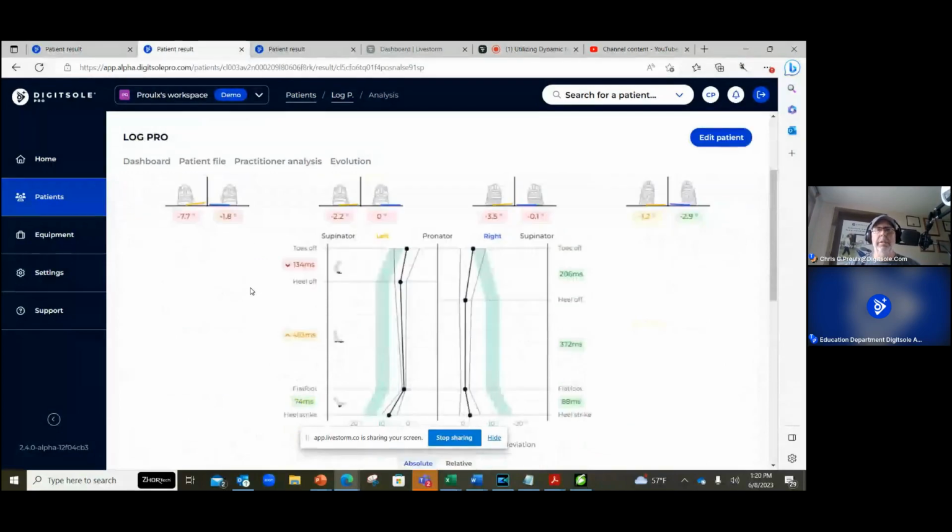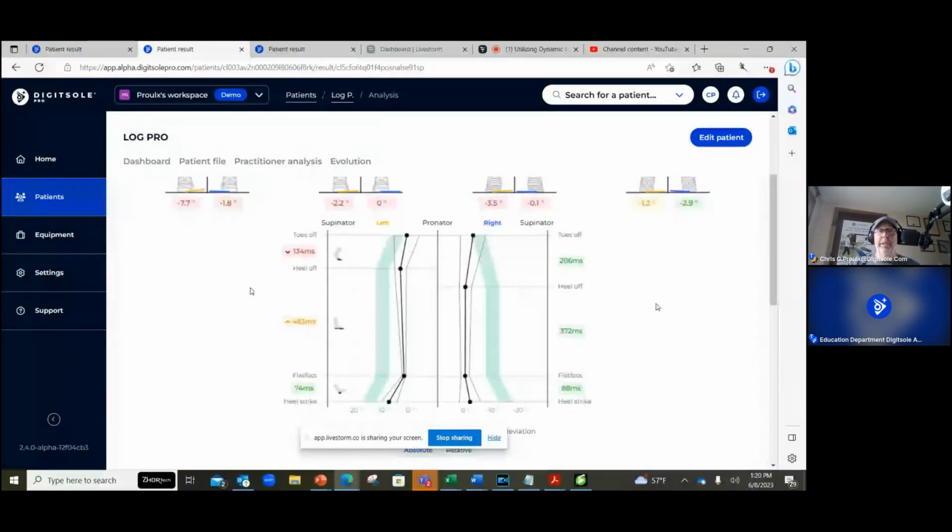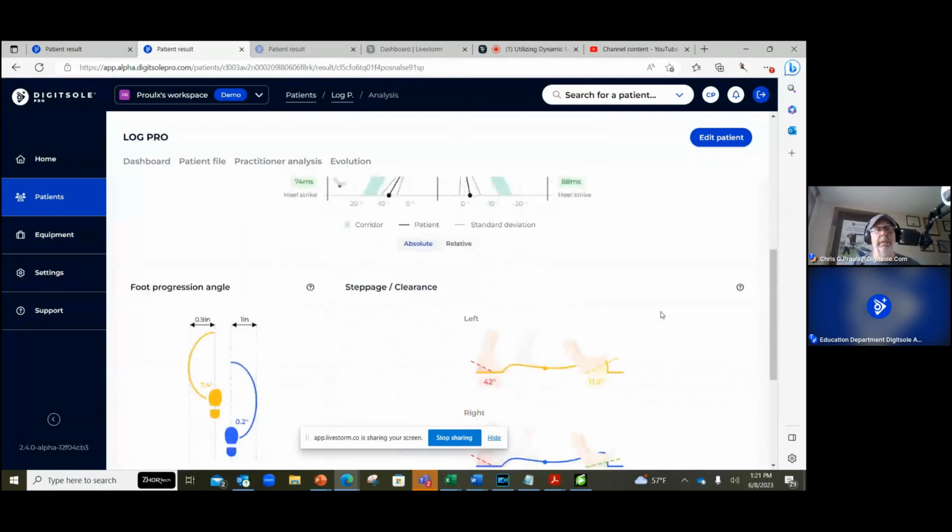So this is him walking, and actually this is a year earlier. And so we can see some of his characteristics on his trajectory, fairly normal here on this left. It's a little bit on the inside, but this is actually normal for an 8-year-old as they're developing their medial arch. And this is a little bit different that we see here on the left. And that's piqued my interest, and not for any other reason because I'm also a clinician. Most people will never see this kind of data, but now I at least have some sense of, okay, what exactly does that mean?